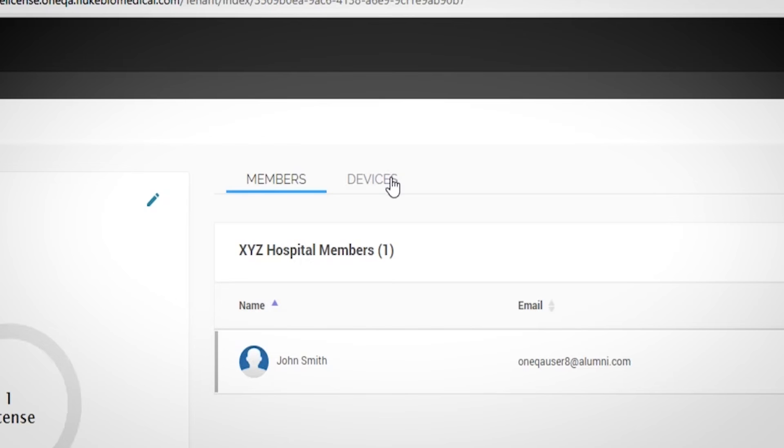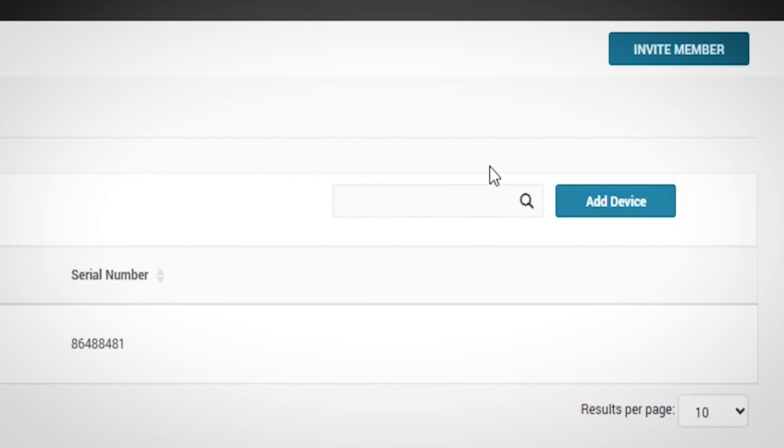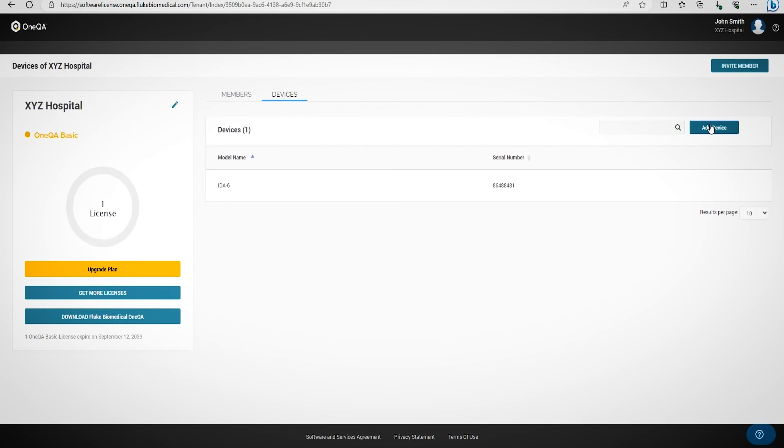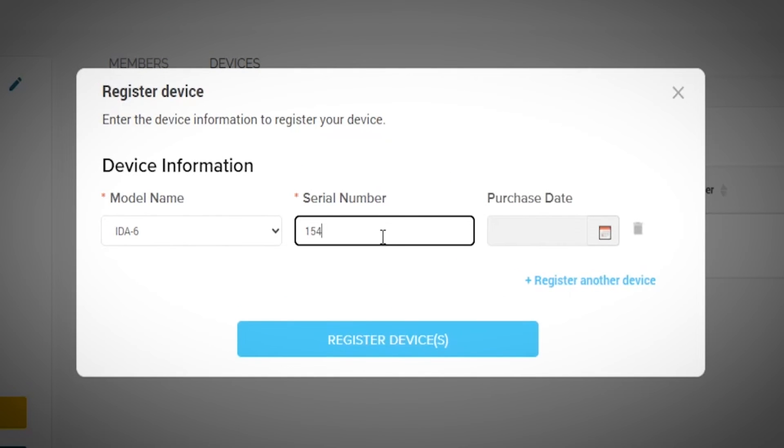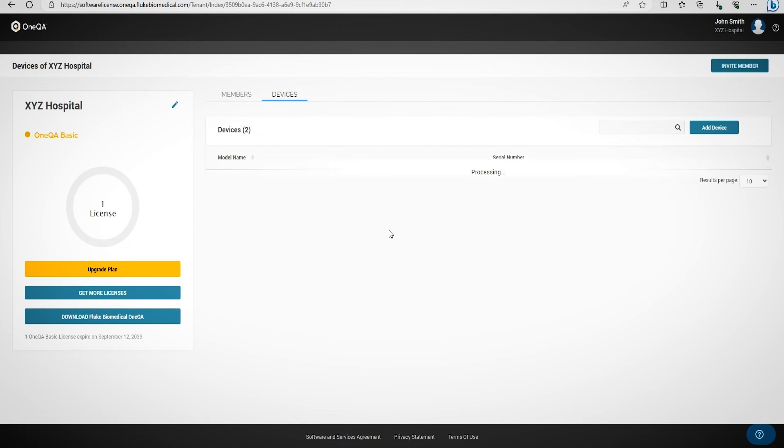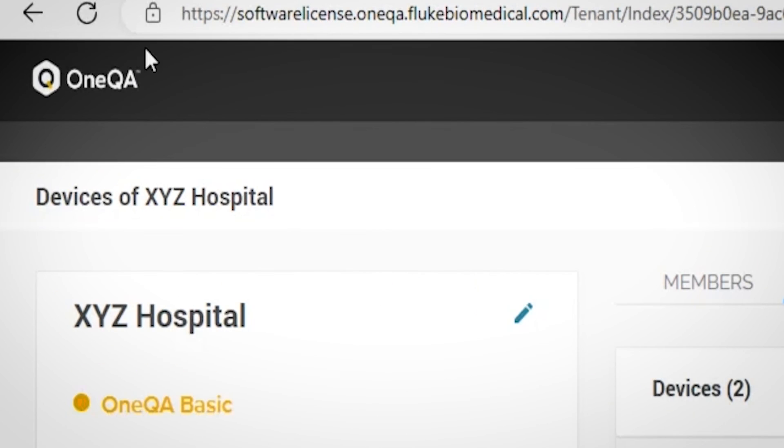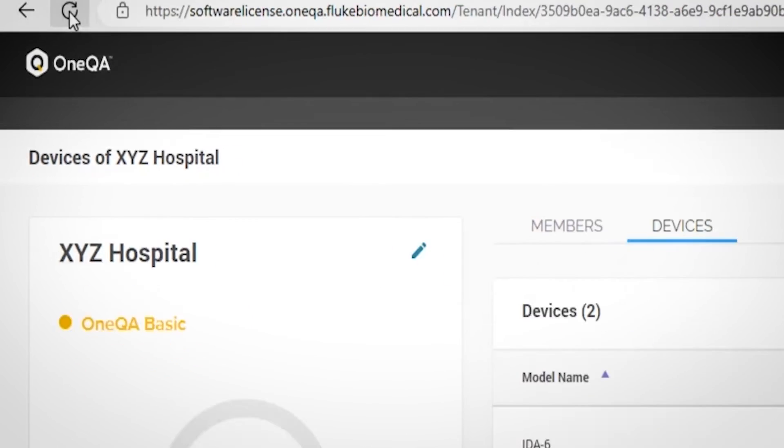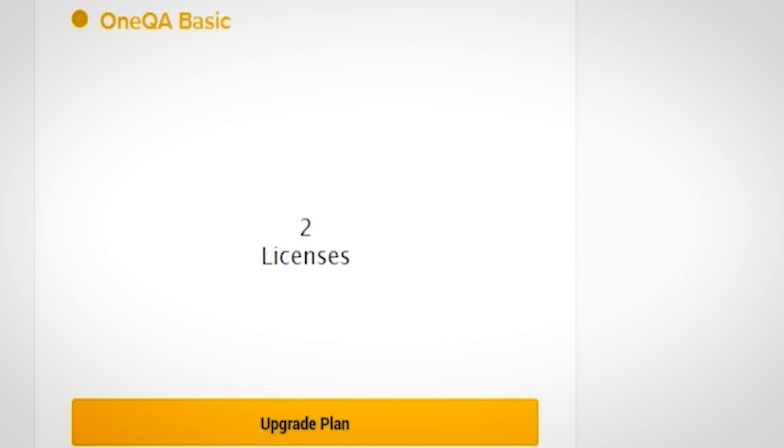If you need to add more devices, such as another IDA6 to your account, go to the Devices section and click on Add Device. Then input the IDA6 serial number and today's purchase date, and select Register. This action registers both IDA6 devices under your account. If you click Refresh, it will update your account to show two licenses because you now have two IDA6 devices registered.